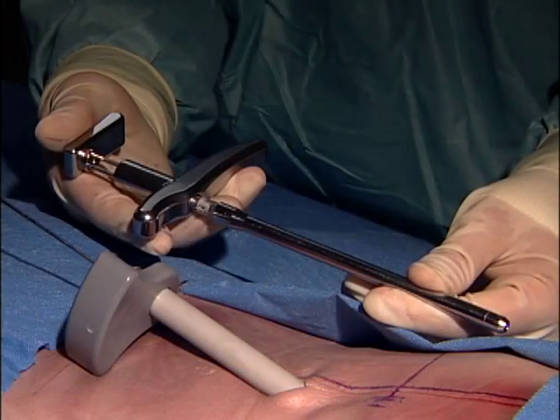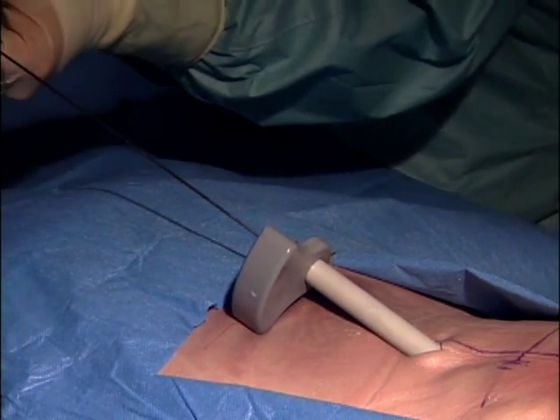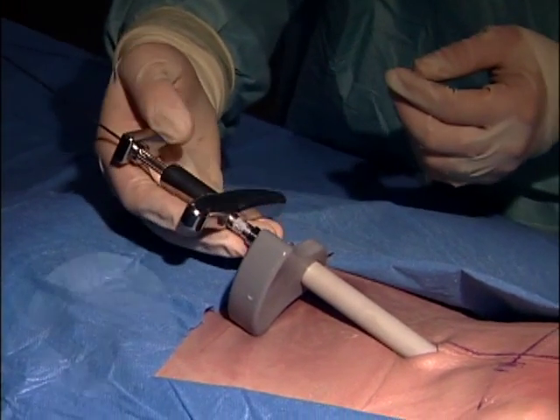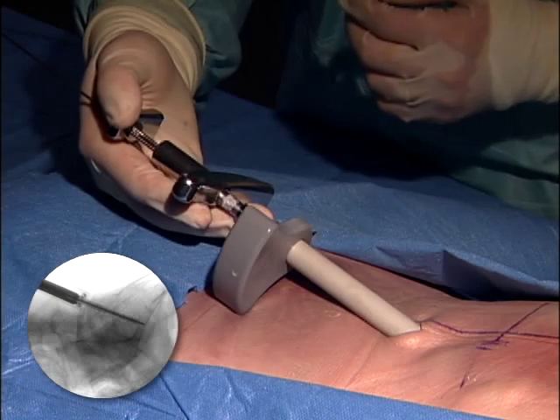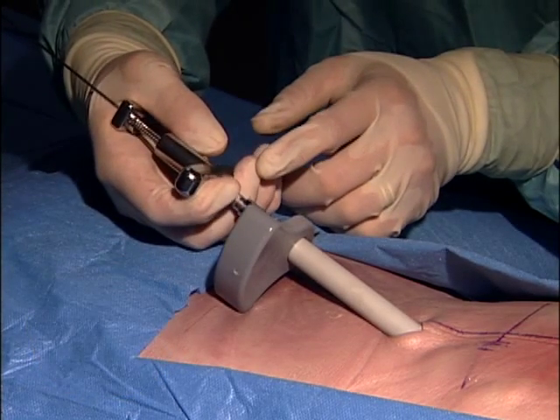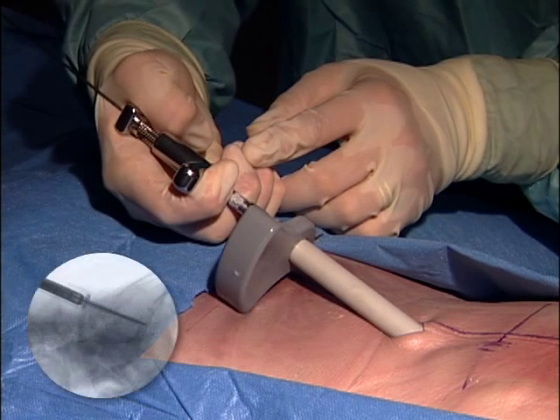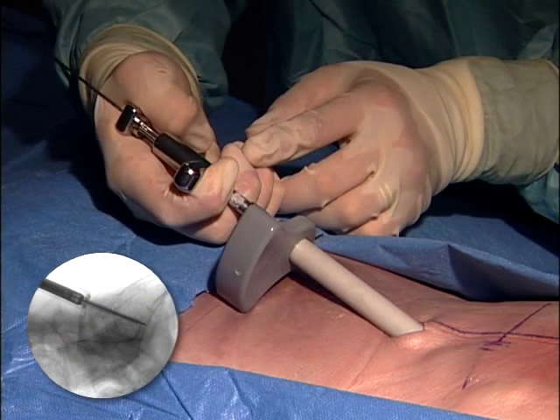The compression tool is passed over the K-wire and onto the pull pin. The device is designed to compress a maximum of 10 millimeters, but the actual amount of compression needed is determined by the patient's anatomy and the surgeon's preference. Using only one hand to compress, the surgeon can tell when the implant is properly positioned under fluoro by watching the self-retaining washer tilt and lay flat against the bone, indicating that the device is inserted all the way.